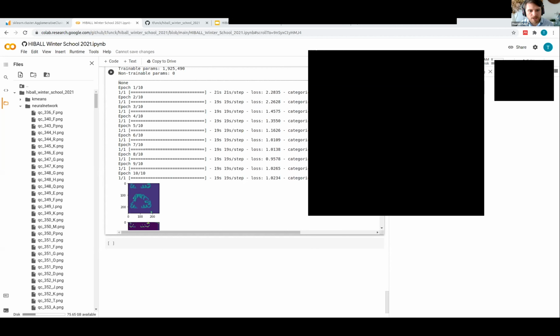little bits of variability. So maybe sometimes 2 sulci will be fused together when they shouldn't be, and sometimes it might miss a little piece of cortex. And so the network will learn enough to be able to spot those mistakes and won't necessarily make those mistakes itself. And so you can actually get a bit better performance from a neural network that's trained on a segmentation than you get from the segmentation alone. I'm not sure if that would be the case with k-means, probably not, but yeah.